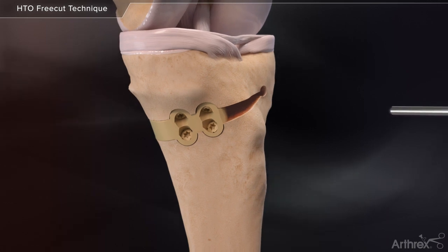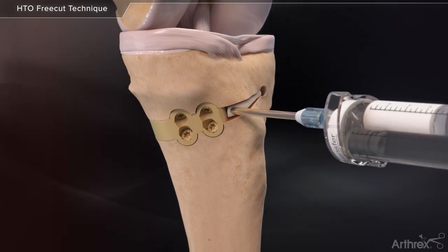Confirm appropriate correction radiographically and insert desired bone void filler.